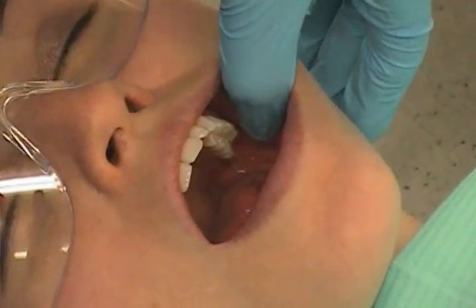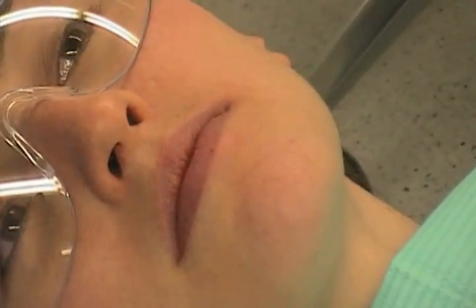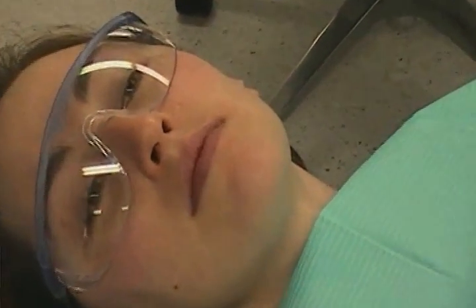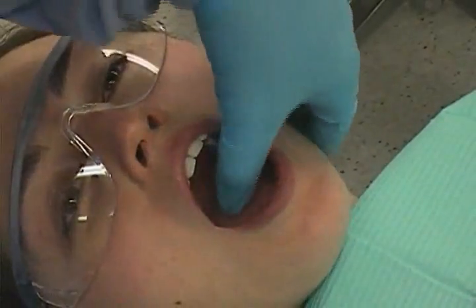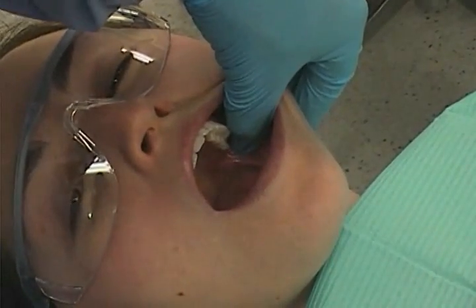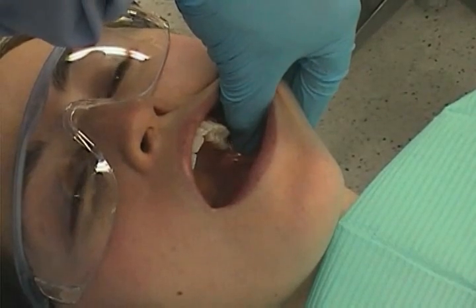The needle gauge and length is a 25 or 27 long. The patient position will be supine or semi-supine, with their mouth open wide for visibility and access. Their head should be turned towards the operator for the right side and slightly away for the left side. The operator position for the right side should be 8 o'clock facing the patient, and for the left side, 10 o'clock facing the same direction as the patient.